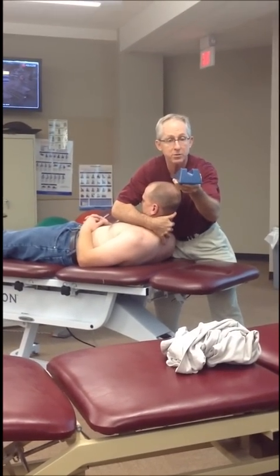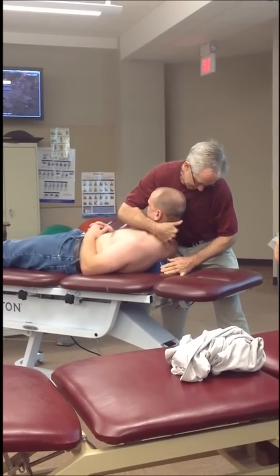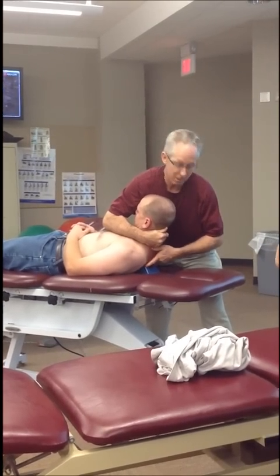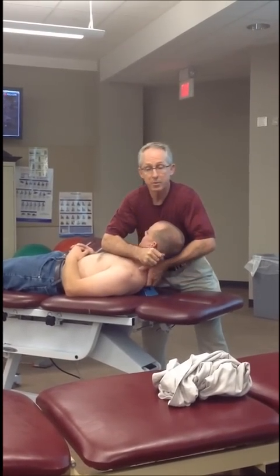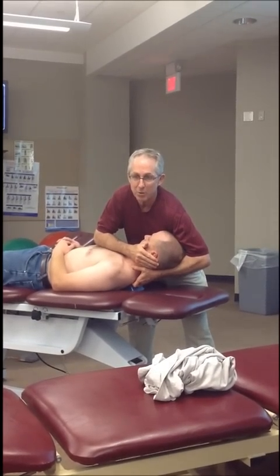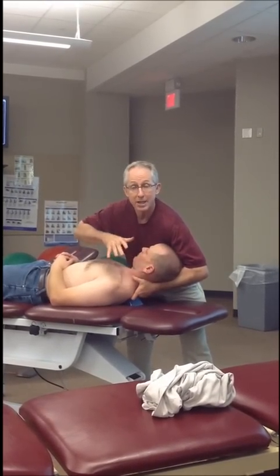Support the transverse processes of the level that I do not want to move. I place the wedge dead center so the spinous process falls into the gutter. Transverse processes sit on top of the posts of the wedge. From that position now, I'm going to check that I actually have freedom to move, and I do. My finger's in the gutter, and I can get that movement of the segment.